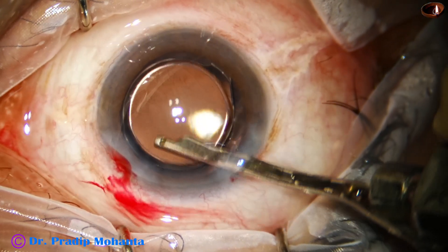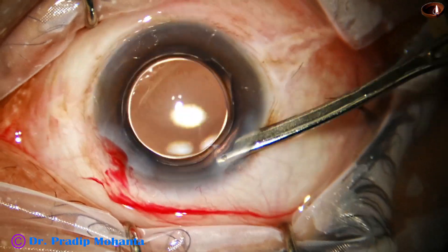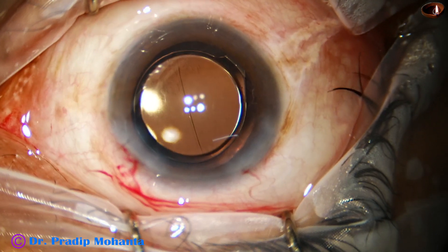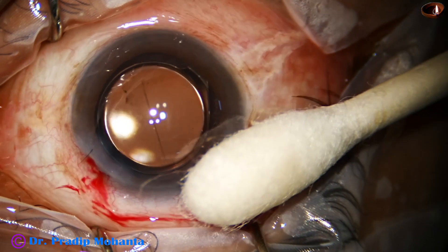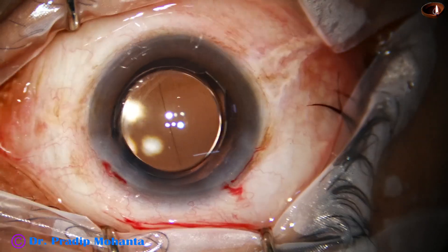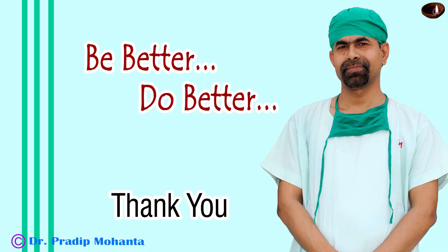So the lens tilt technique is a good way of managing soft cataracts where we cannot hold the nuclear mass. Other good techniques are the use of Mahanta's Bridge Hopper or the Carousel Technique. Thank you very much for your attention — I hope this video will help you in developing your surgical skills.